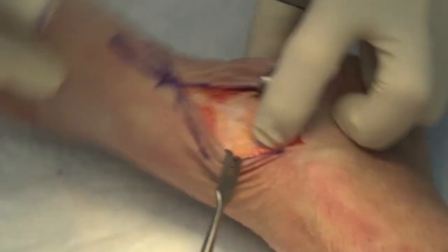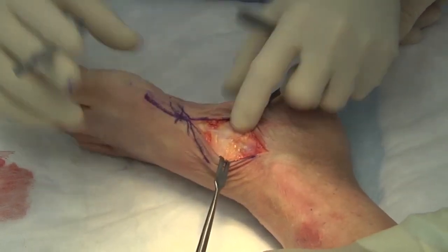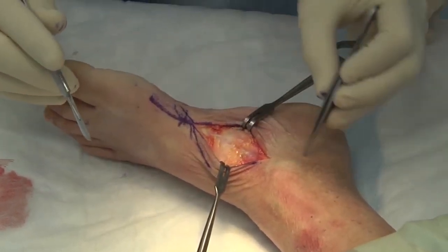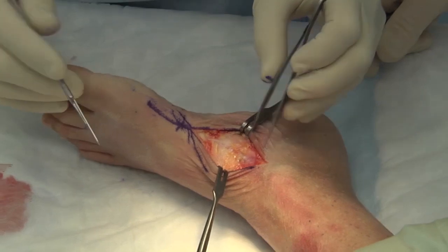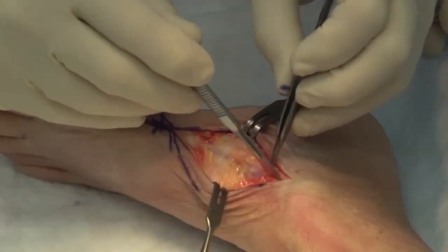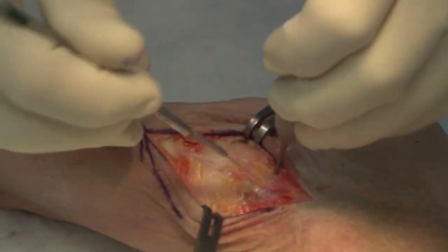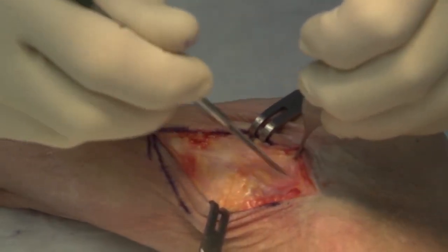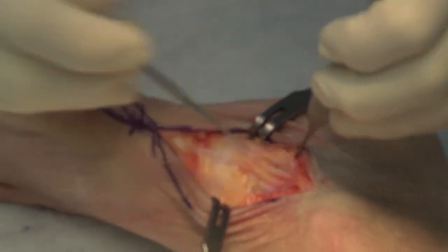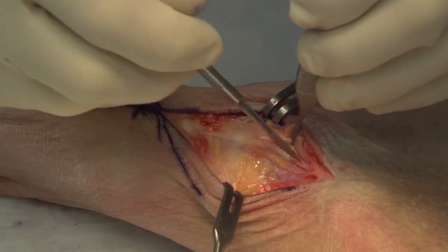It's useful to invert and evert the foot so you can feel where that talonavicular joint is. Here's the tuberosity right here, and the post tib tendon is going to be coming down attaching to that. I will open that up just dorsal. Sometimes you can come into the posterior tibial tendon sheath just to identify where it is, but typically that's not necessary as part of the exposure — and there's the tendon sheath right there.